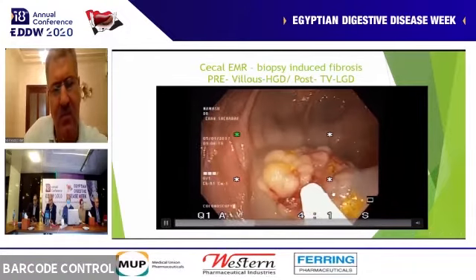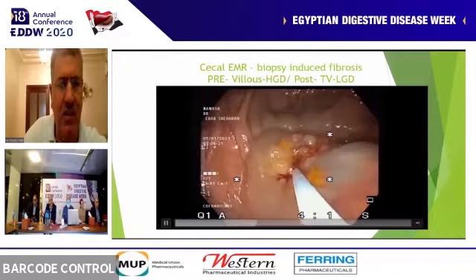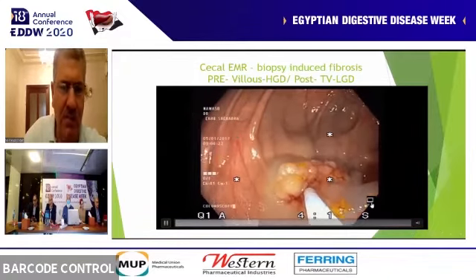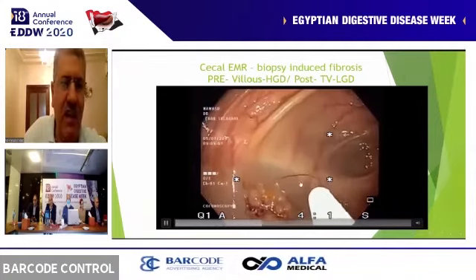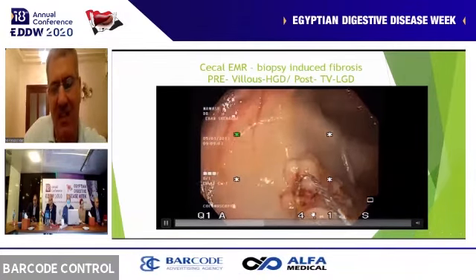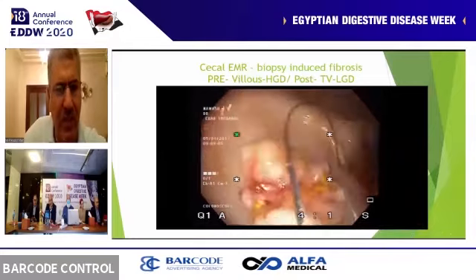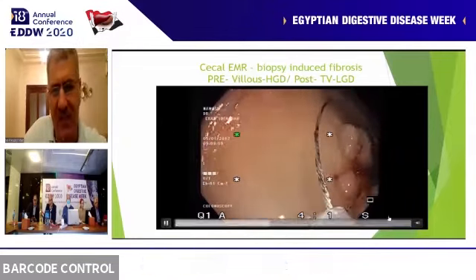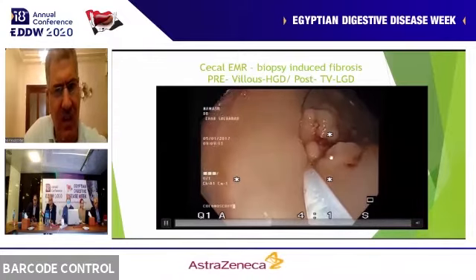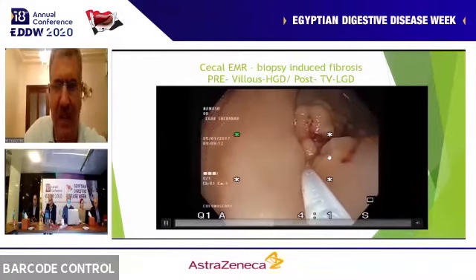Now, you can see here after I injected the whole polyp away from the fold, it did raise beautifully. I did inject the center because with biopsies in the past, telling you that there's no cancer, it's probably safe to do that. And when you have a poor lifting in the center, that's probably, again, if you're sure it's not cancer, might be acceptable.